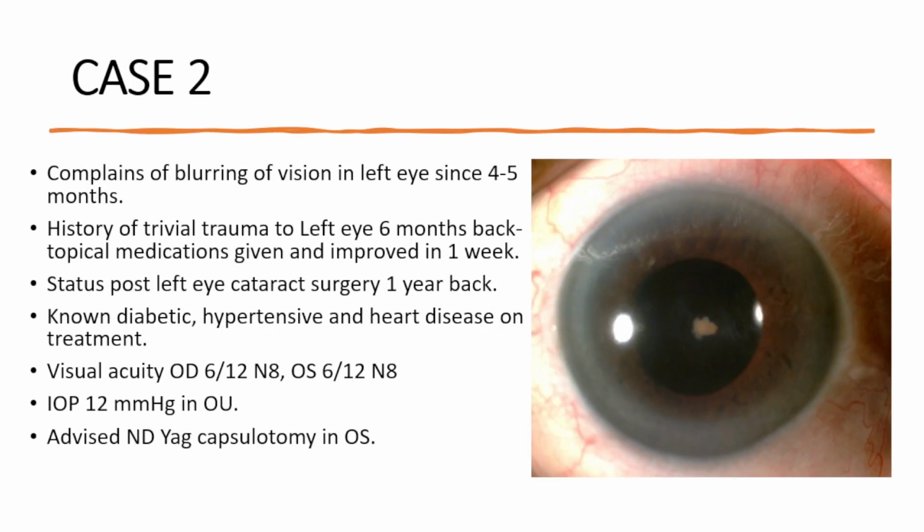Now coming to the second case. What was the intraop finding? Was there an RD or no RD? There was no RD, sir. No RD. How would you explain that membrane then? What you saw on ultrasound, you have to correlate clinically. So maybe it was a membranous echo secondary to incomplete PVD itself. It could be a thick posterior hyaloid, which is now separating, and it's highly reflective, and probably may have less mobility also. It's possible.